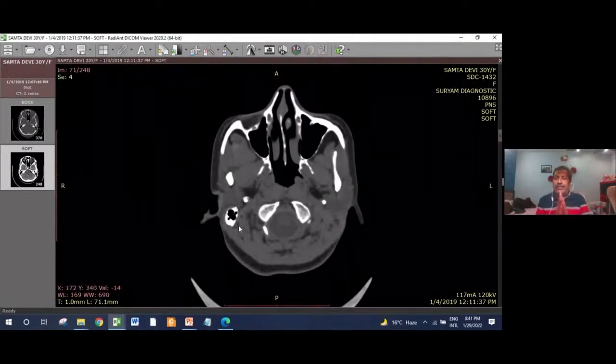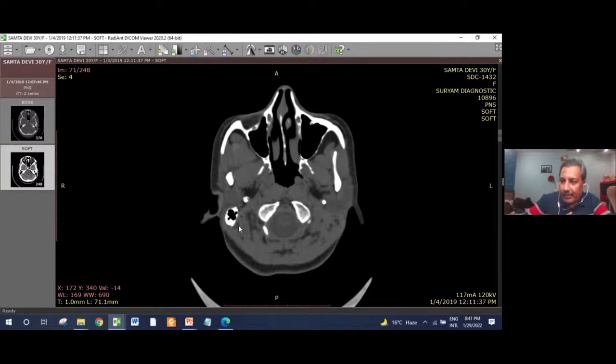Now, this is one investigation used for inflammatory disease of the paranasal sinuses, that is chronic sinusitis, and for that CT scan is more important. For other pathologies, for tumors, for other skull-base pathologies, CSF leaks, or to get any other soft tissue details, MRI is the investigation of choice. MRI has an inherent versatility of giving you a variety of sequences, hundreds of sequences, where every sequence will give us different details for tumors, benign and malignant.